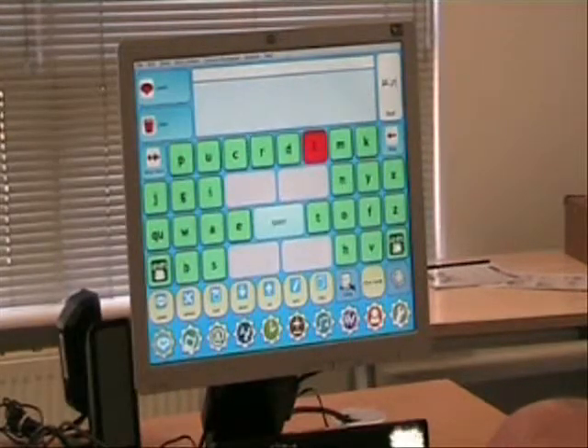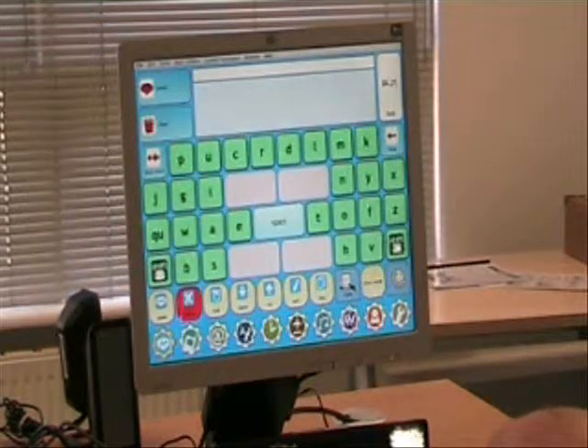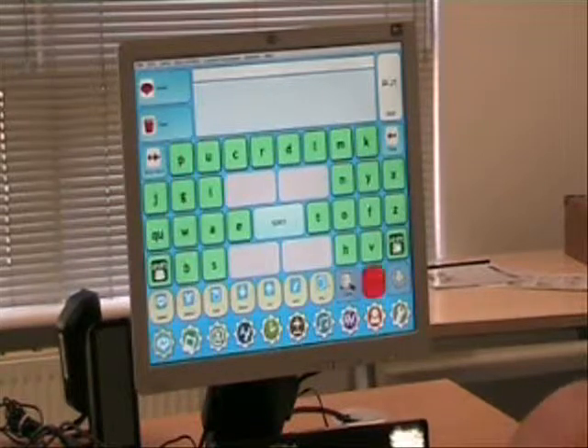Now I just want you to look at the other functions of the Grid. If you look down at the bottom of the screen, you'll see there's an icon of a music note there. Can you look at that please? It's just going to open up the music player.